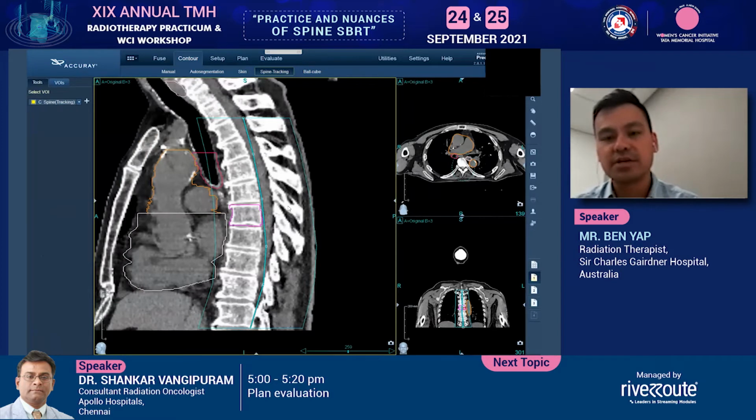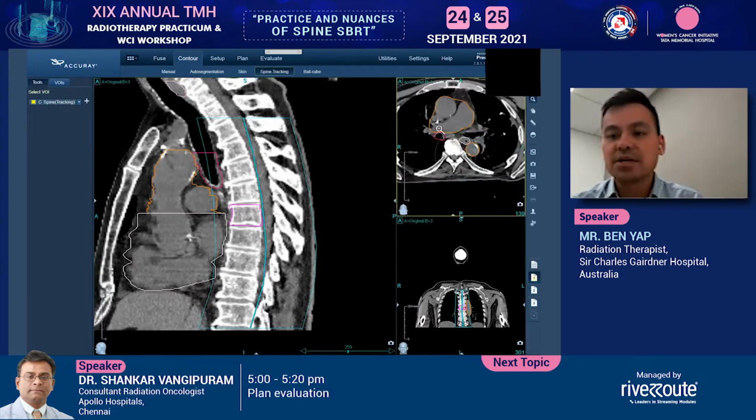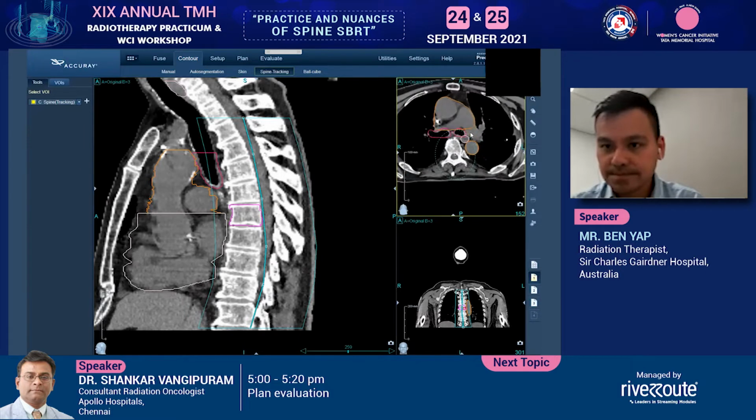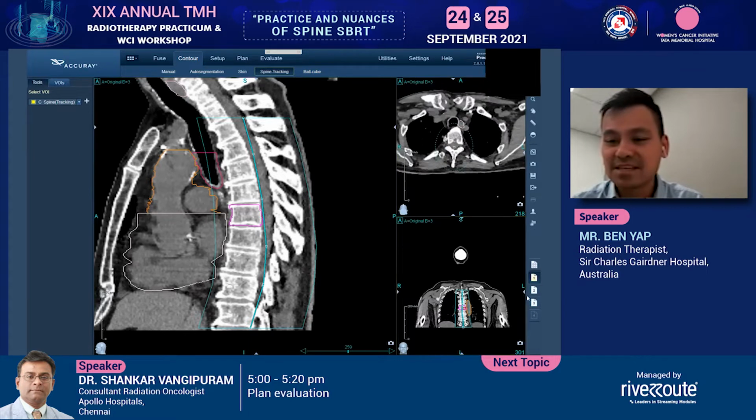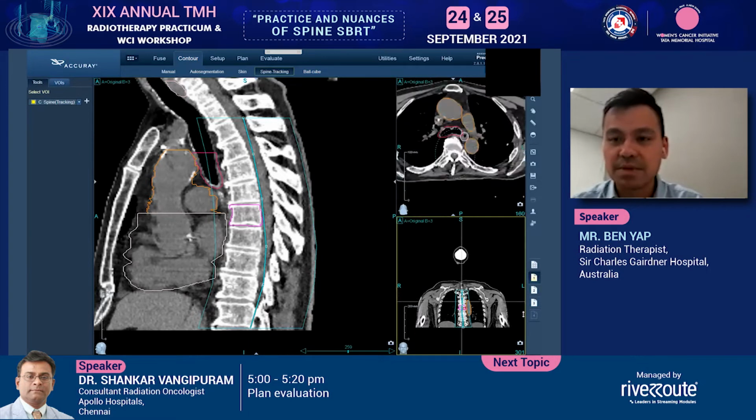Now, the purpose of a spine tracking volume is actually for treatment delivery. Apparently, and according to Accuray, it helps clear the clutter that isn't relevant for your treatment delivery, which in your case will be the spine, the vertebral body itself, the spinous processes, and the transverse processes and pedicles. So that would be everything outside of that. That's what making a spine tracking volume is supposed to do. What we found is that if you don't have it, it doesn't matter. You can still treat. It's not a big deal.